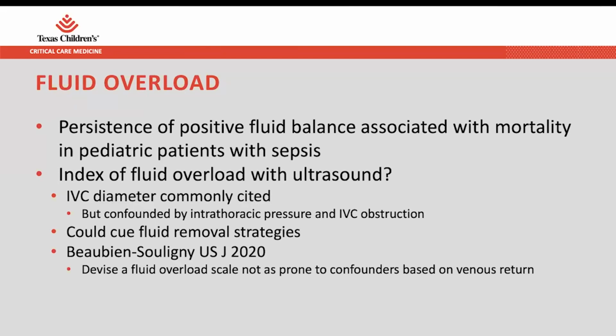And the thought with ultrasound is just that this will save us from having to put in an IJ and checking their CVP. And though there's always been controversy over the accuracy of CVP, we know that it does seem to have a lot of positive predictive value in terms of a number of the patients that we see, at least at the extremes of their values in the right therapeutic sense. And it's enough that we haven't given it up.